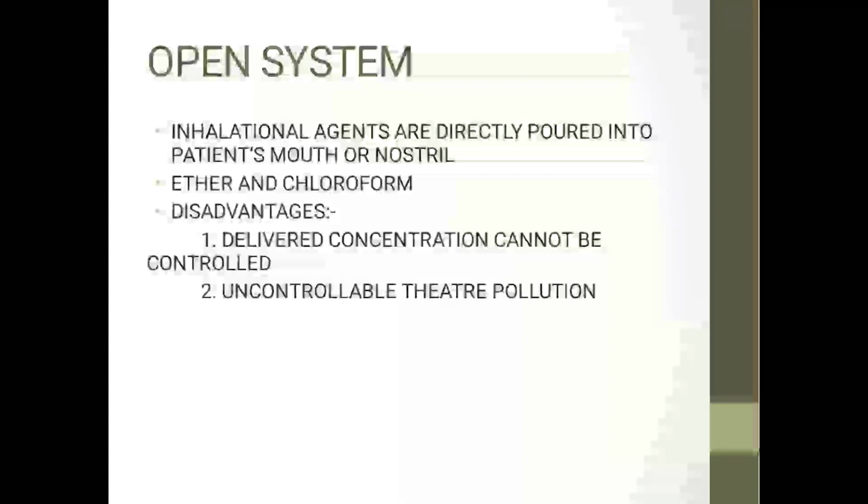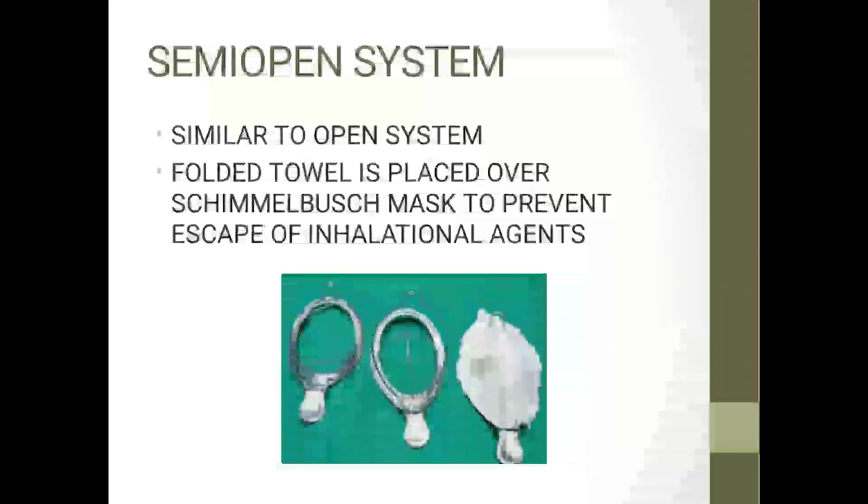In earlier days, we used ether and chloroform as inhalational agents. We also have disadvantages in the open system, where the delivered concentration cannot be controlled, and it also causes uncontrollable theatre pollution. The semi-open system is similar to the open system. A folded towel is placed over the Schimmelbusch mask to prevent the escape of inhalational agents.